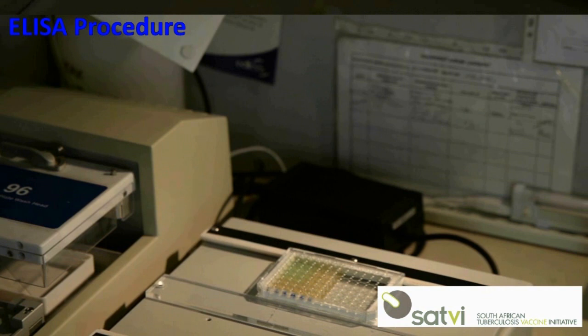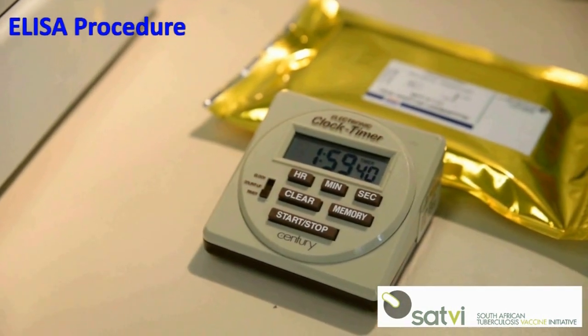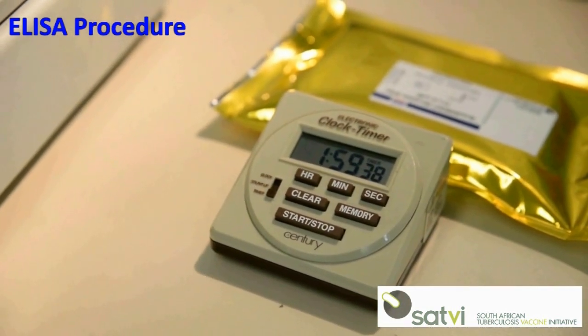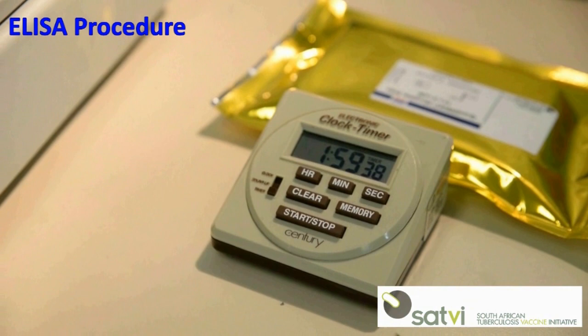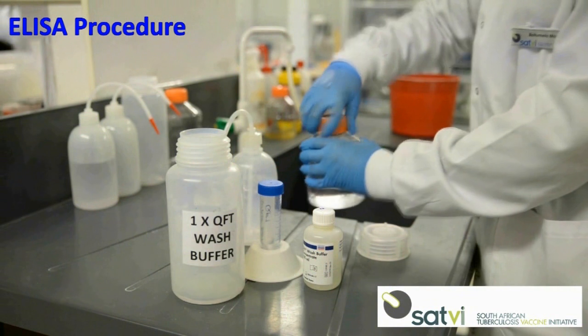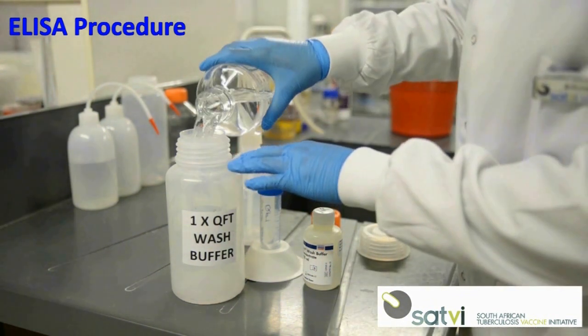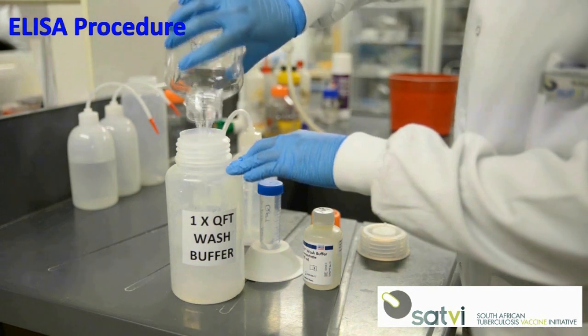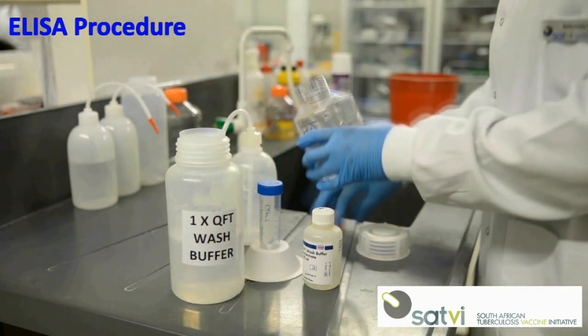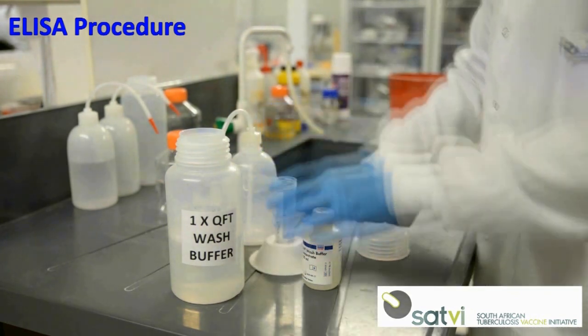Cover the plate with a lid and mix on the plate shaker for 1 minute at waveform 20 and amplitude 6, taking care to avoid splashing. Incubate the plate at room temperature for 120 minutes; the plate must not be exposed to direct sunlight during incubation. While incubating, prepare the working strength wash buffer by adding 50 milliliters of 20 times concentrate wash buffer to 950 milliliters of deionized or distilled water and mix gently.